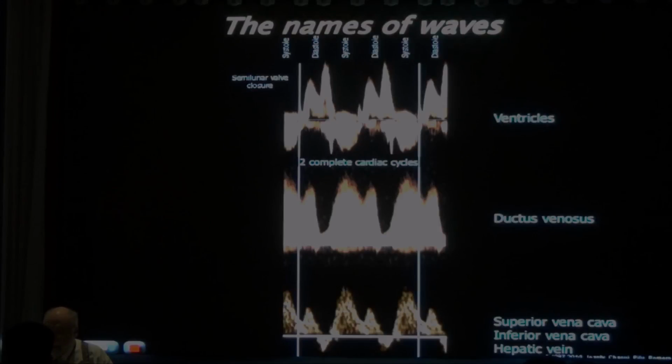Okay, and the Tei index, which is a measurement of the efficiency of the ventricle, is the distance between this and this here, minus this. So there's a lot of information to try to get. So when we do some demonstration, I want you to look at the tracing and not get some sort of wiggly line where you can measure the heart rate. That is not sufficient. I want you to try to get EAV and there's two tracing.